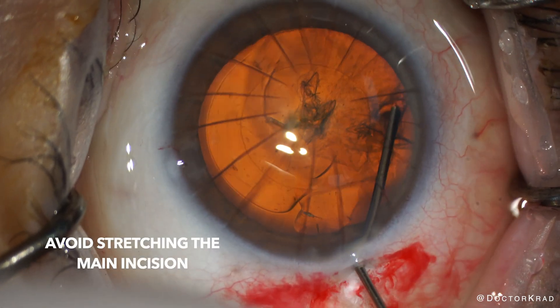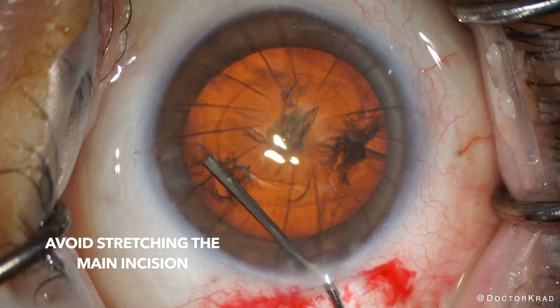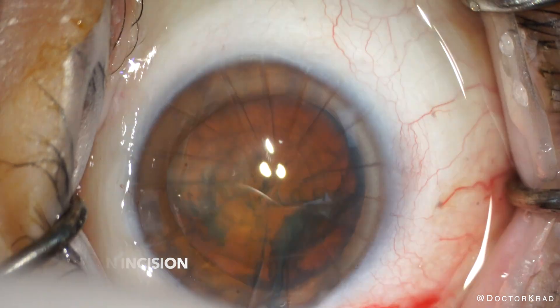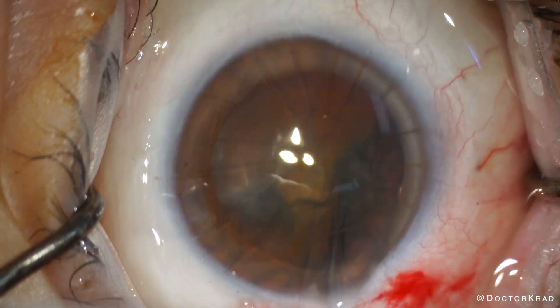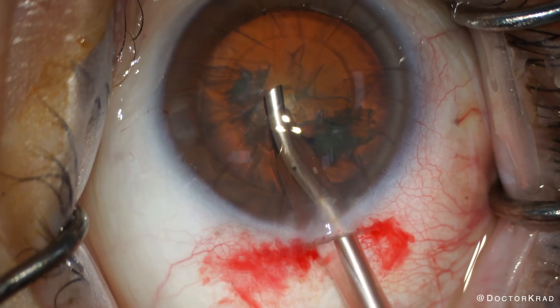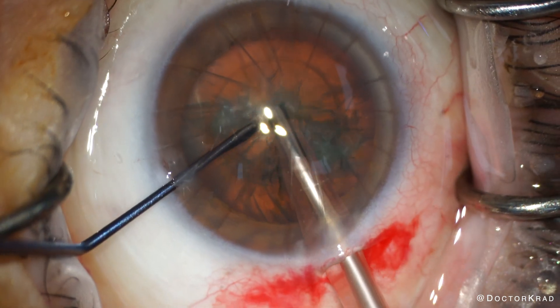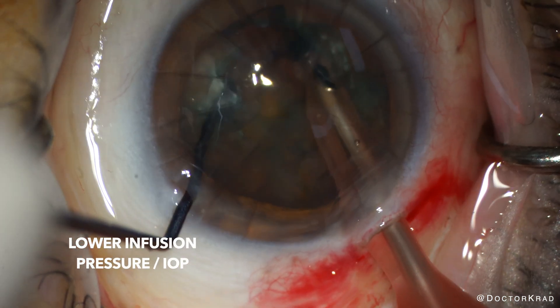Likewise, you want to avoid stretching your main incision. This could cause your incision to tear in the periphery and tear into the previous RK cuts. Here I'm just rotating the cataract to loosen it from the capsular bag, and next we will be emulsifying it with the FACO unit. I did lower the infusion pressure on the FACO unit so that there's less stress on the RK incisions.